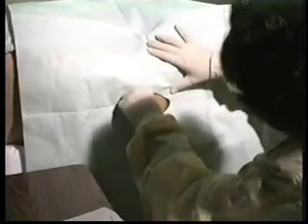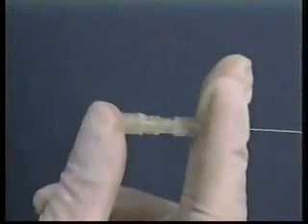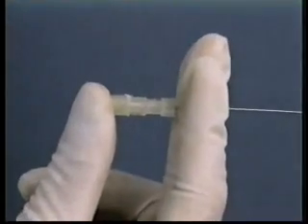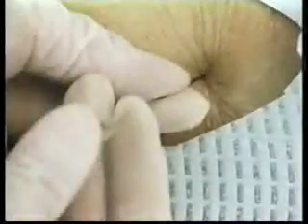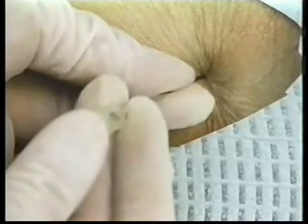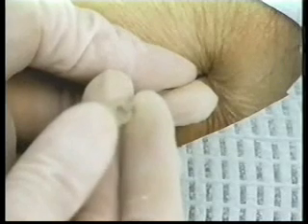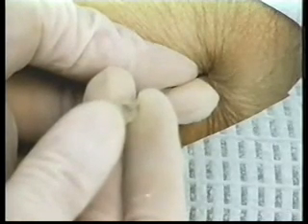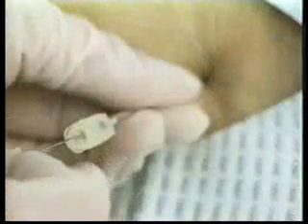I'm getting ready to start. Let me know if you feel any pain or any kind of numbness or tingling. Place the needle between your index and middle fingers with your thumb on the back of the stylet. Now seat the needle. Advance the needle, directing it at an angle 10 to 30 degrees cephalad, aiming toward the umbilicus. Be sure that the bevel is up, so the ligaments will be separated rather than sheared.